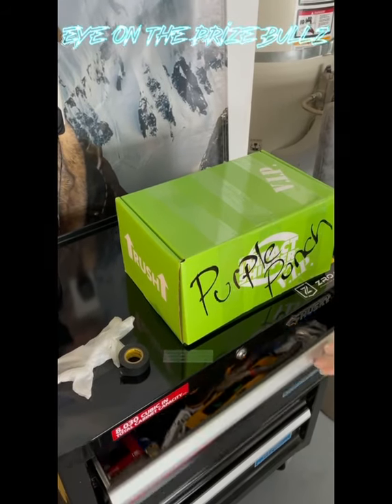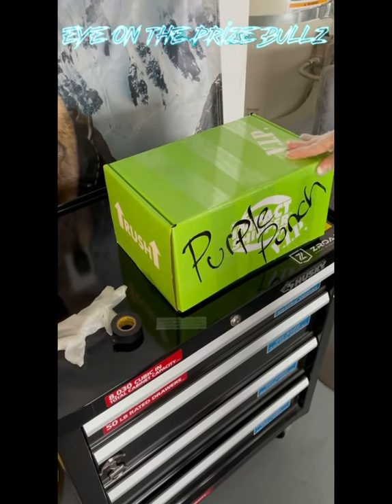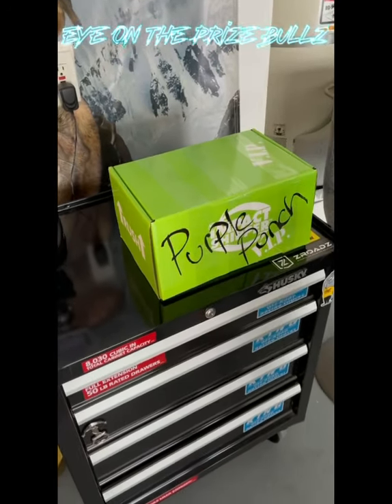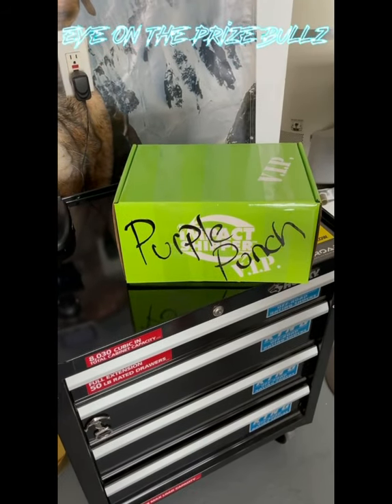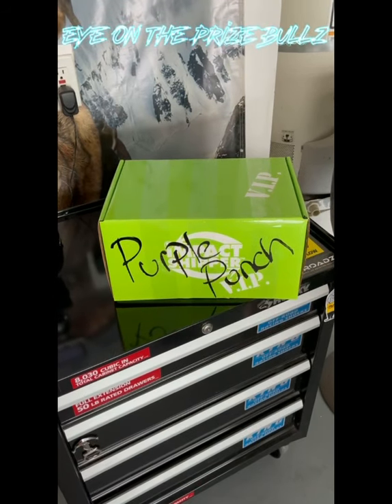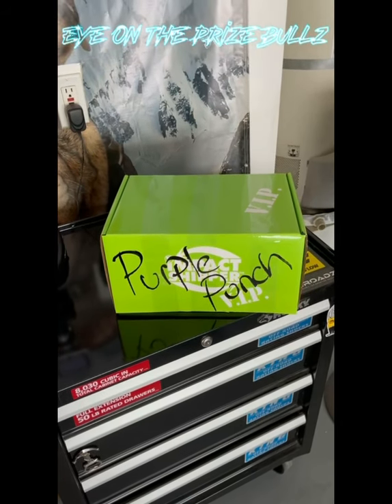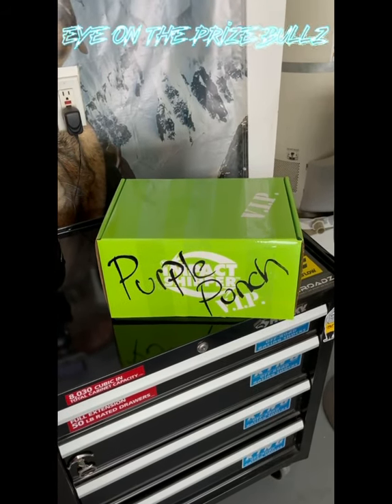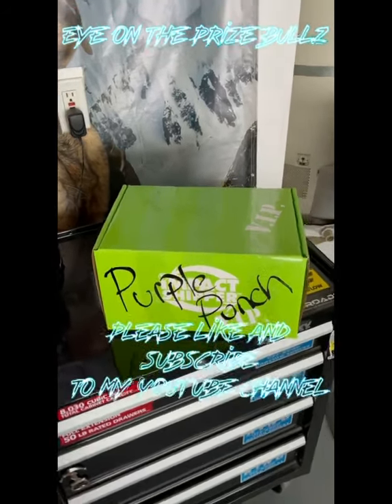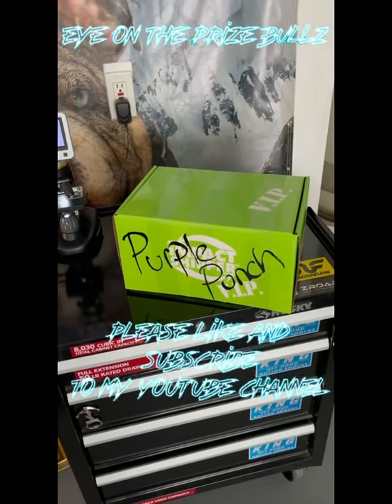You do want to put a good amount of tape on there just so it's well protected and it's not going to open up. And again, guys, this is how we prepare our semen. We've been doing this for a long time. We appreciate all comments and suggestions. This is our style and this is the way we do things. This is Eye on the Prize Bullz and this video was how to prepare and package semen. Thank you very much, guys.